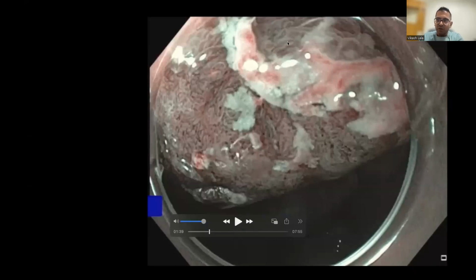So if you look at my mouse, that's the regular area. And this whole area here is actually demarcated. And the area within the demarcated area is not regular. It's irregular, but there still is some structure. You're still seeing some blood vessels. You're not seeing that amorphous whirlwind total loss of vasculature. So I call this a demarcated area.